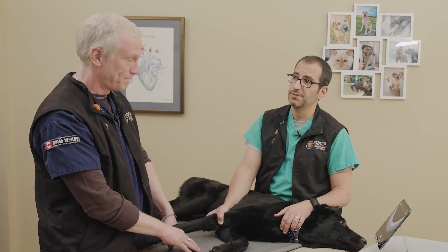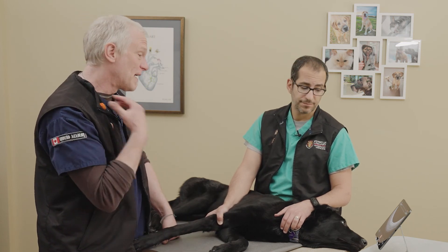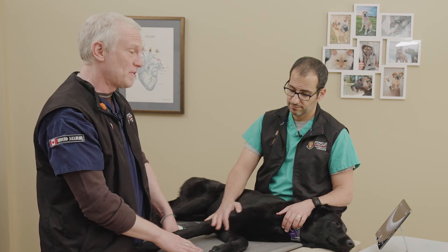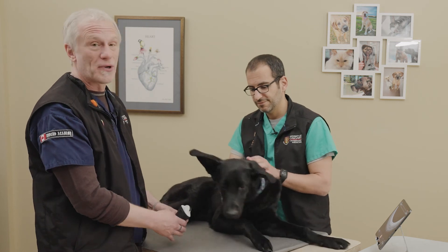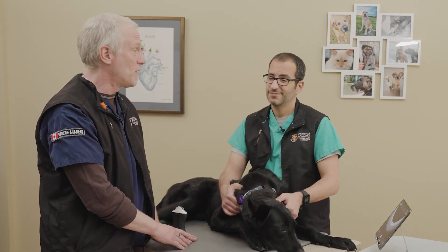Or a chubby dog — that's also very hard sometimes to feel that vessel. Absolutely, and we've done this again for central line placement in patients that are very difficult to access. Our technicians are also trained to put arterial catheters in the dorsal pedal artery as well. So that is vascular access using point of care ultrasound — something really cool, really neat, and very helpful.